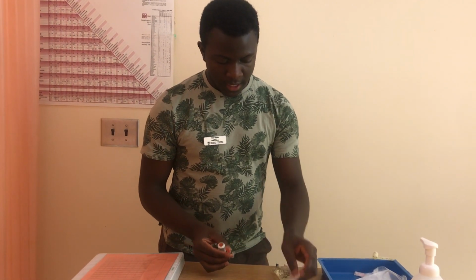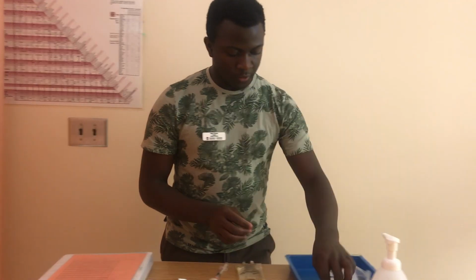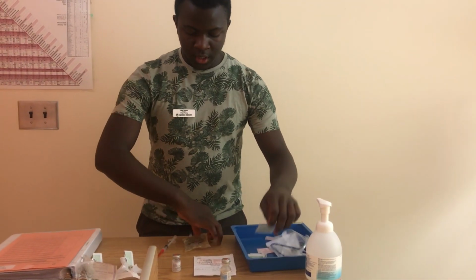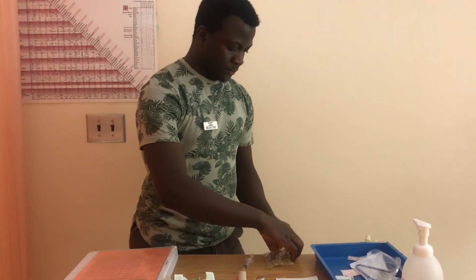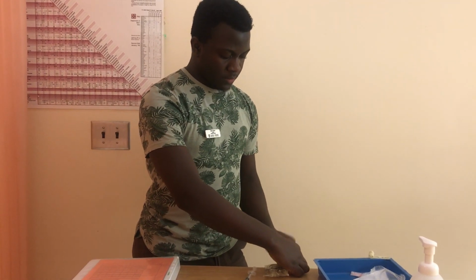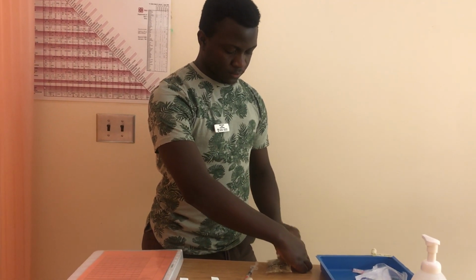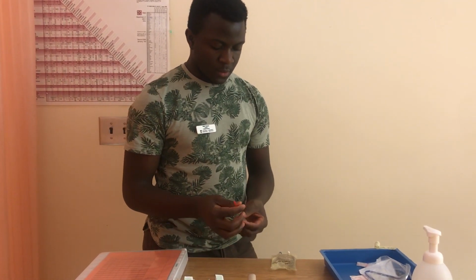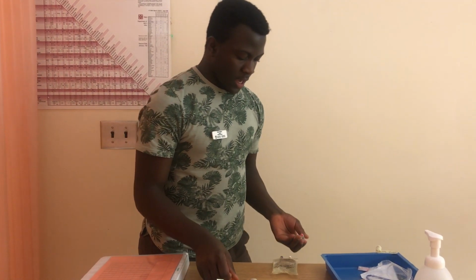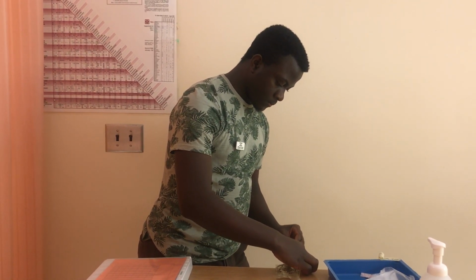So I can go ahead and inject this medication in my syringe. But just before that, I will clean my port to make sure I am maintaining sterility. So I'll clean my port here for 30 seconds. Now let that dry for 15 seconds as well. And once that is dry, I will go ahead and inject my medication using my vial and syringe.